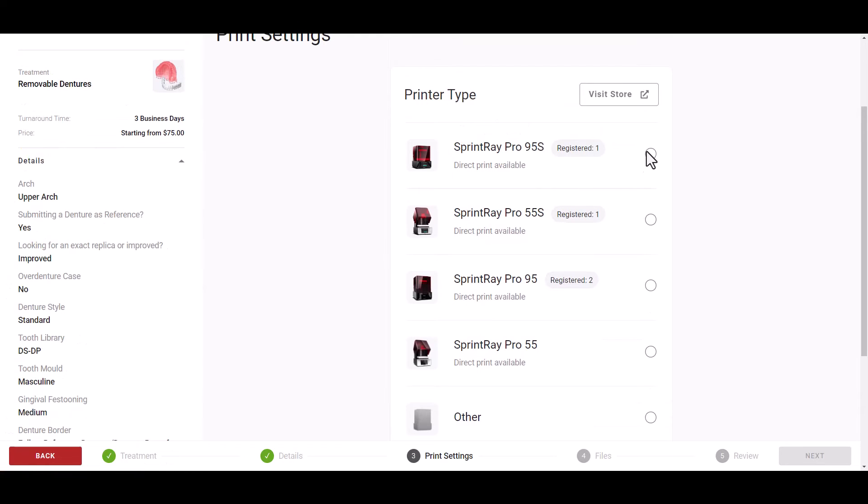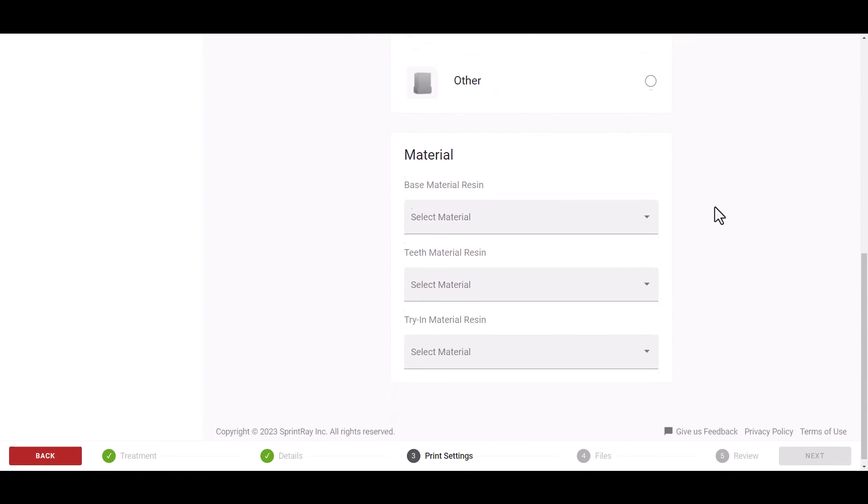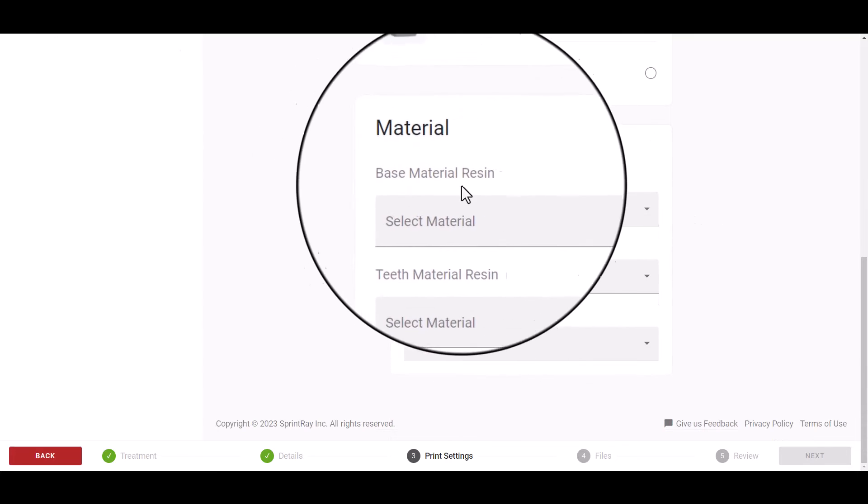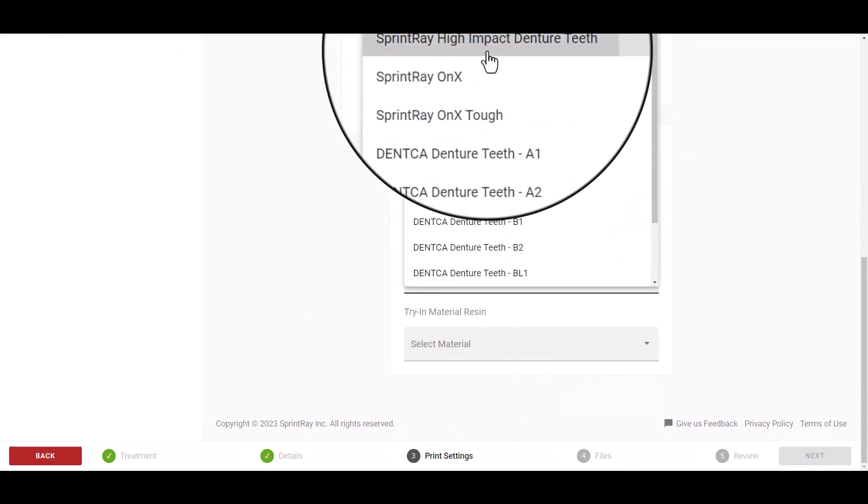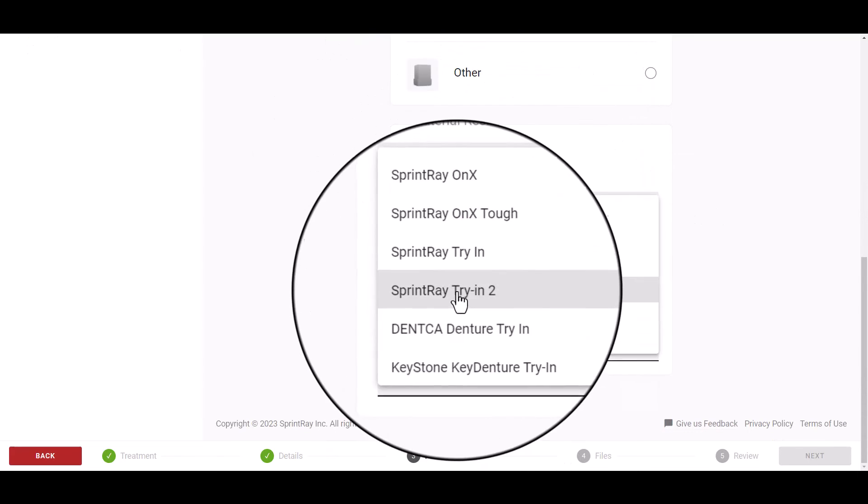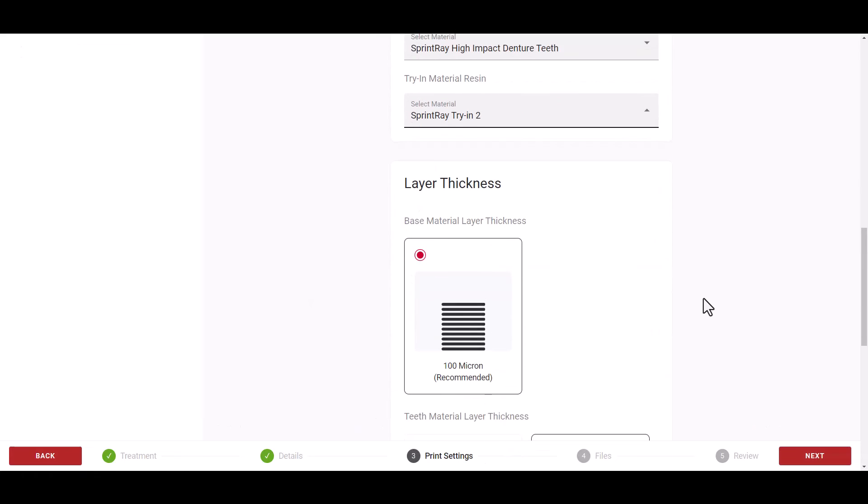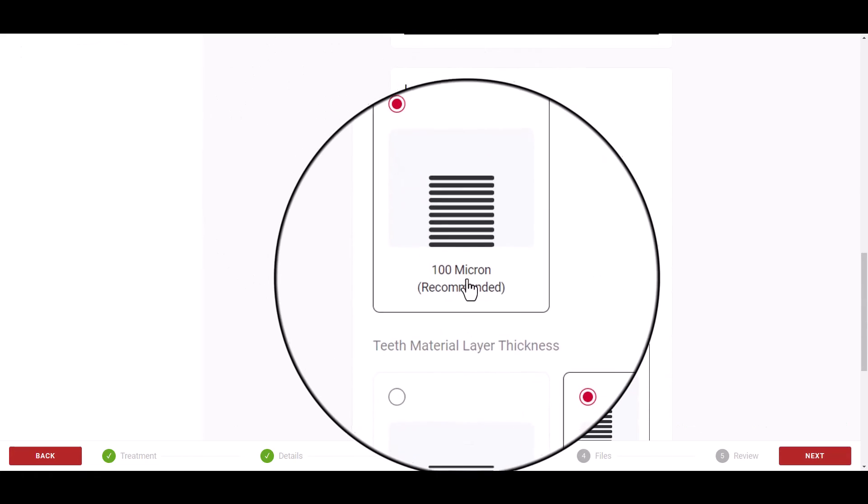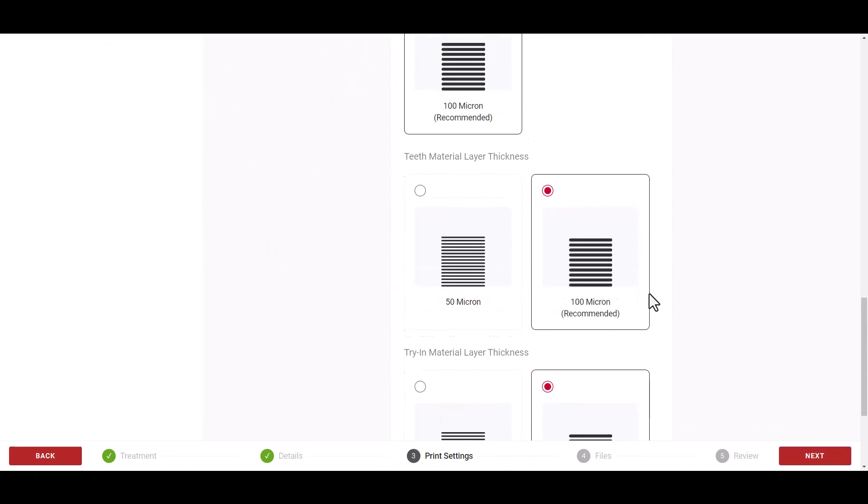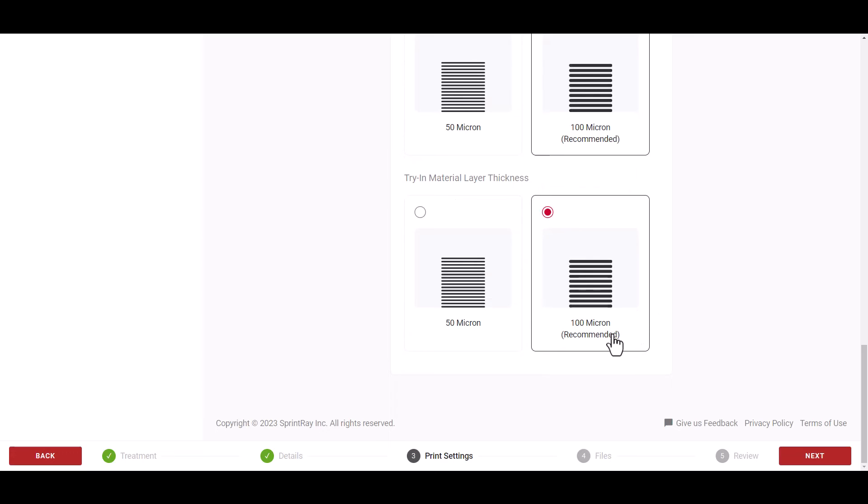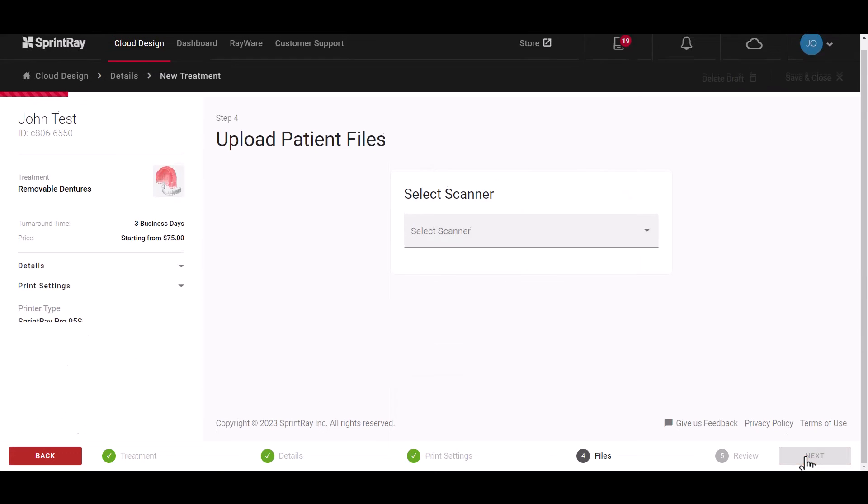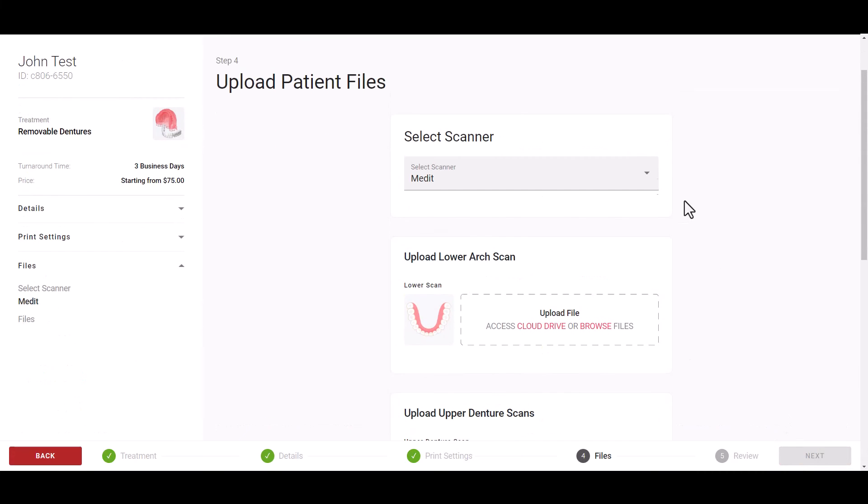SprintRay cloud design will also show you what types of printers you have registered to your dashboard account for file submission.